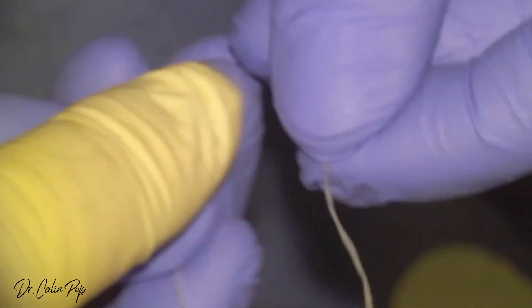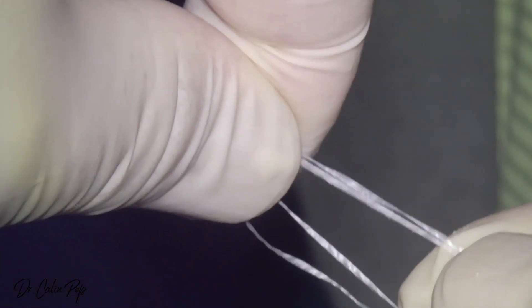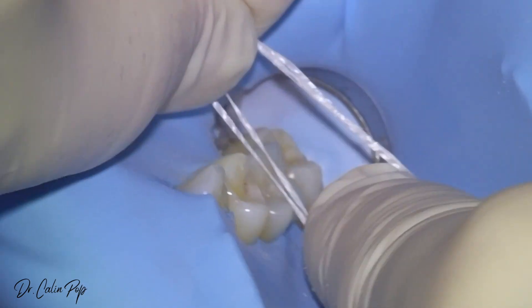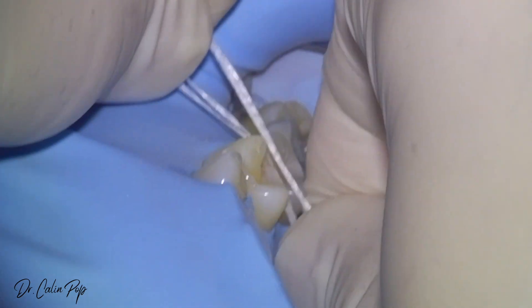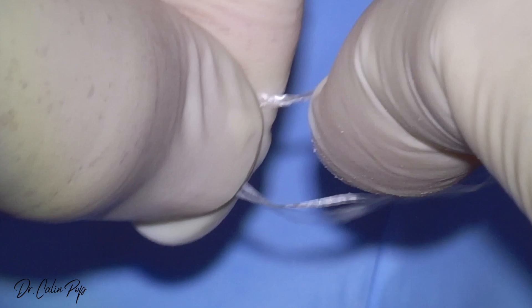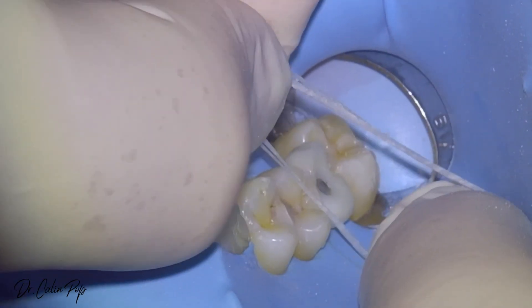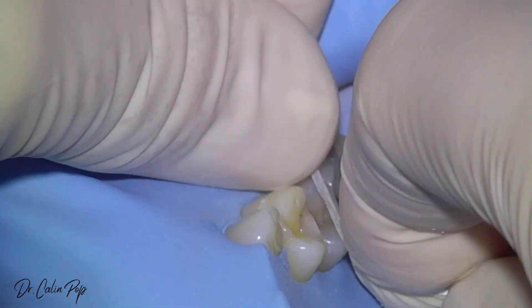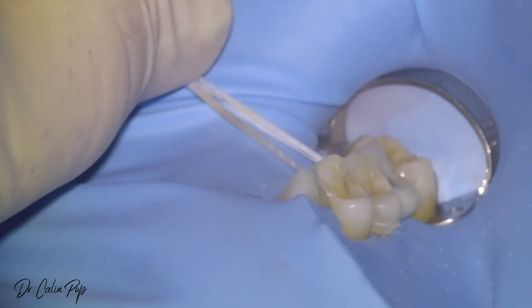She's holding with two hands. And I'm holding the loop. I grab with two fingers from here, and only one finger from here. Why? Because when I insert it, I have a good grip with two fingers — I can't do it with one finger. The other side is tensioned. And look what I'm doing — I'm reversing. Because I'm holding here.